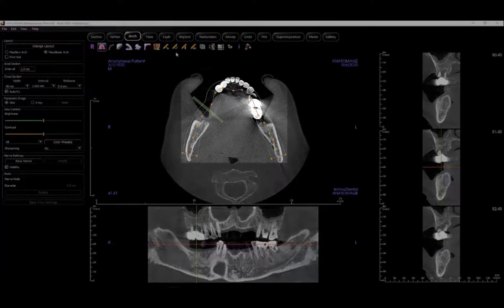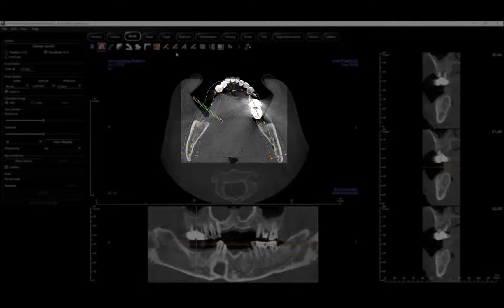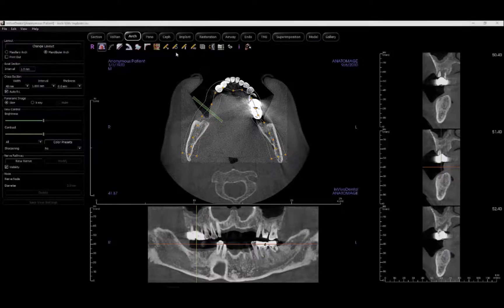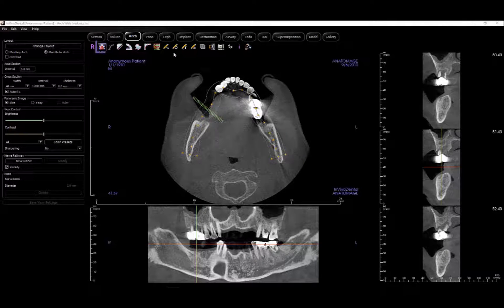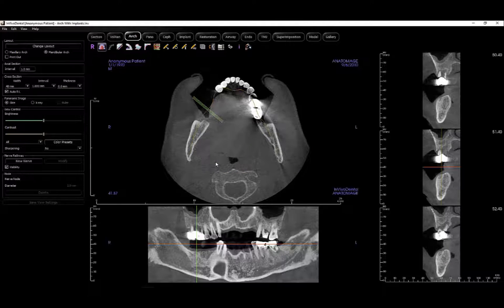The NVivo software predicts an initial arch spline based on density along the arch. This arch spline may need adjustment as all patients are different. You can hide the arch spline shape by clicking on the arch spline tool, or create a new arch spline by clicking again and selecting new.